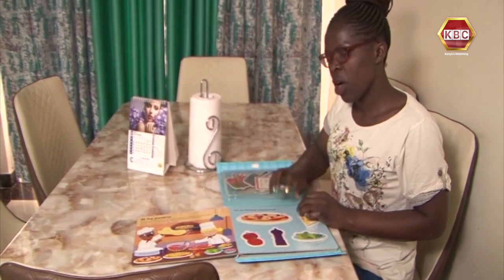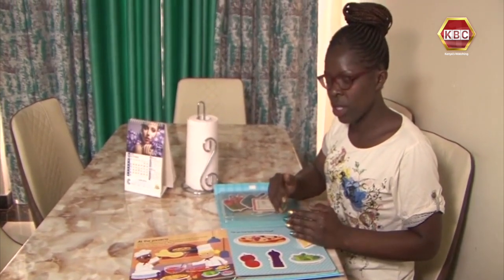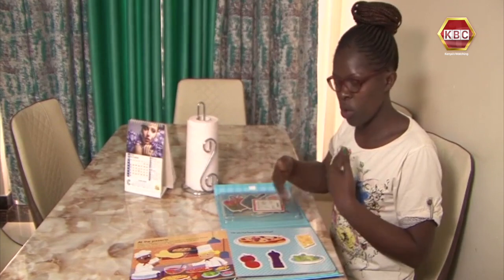Lina, who is an auditory verbal therapist, says the practice is not widely used in Kenya. In Kenya, it's fairly new, so we say we have graduated once the child has gained those milestones. Audition, they can listen through their device. They have the speech outcomes. We have the language outcomes. That is when we graduate the child. Speech therapy also helps in developing speech.